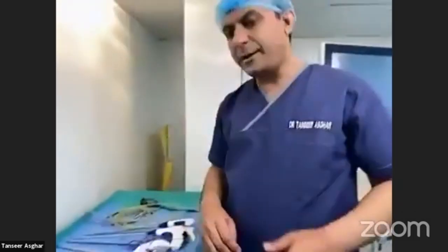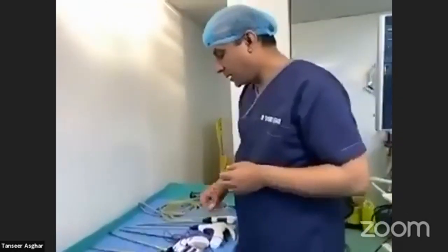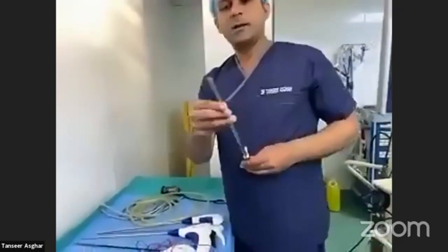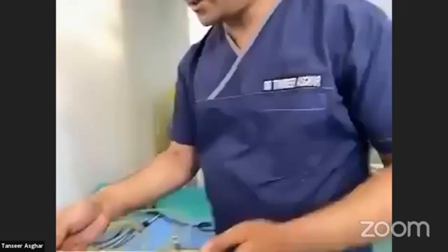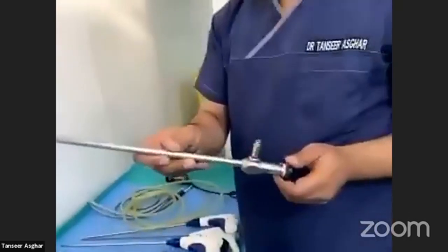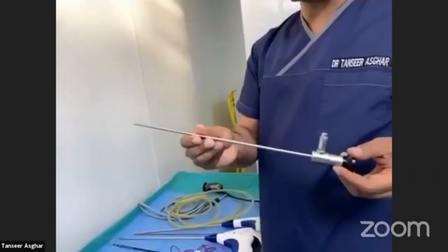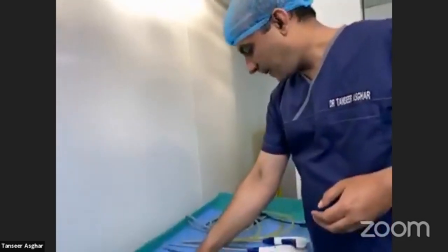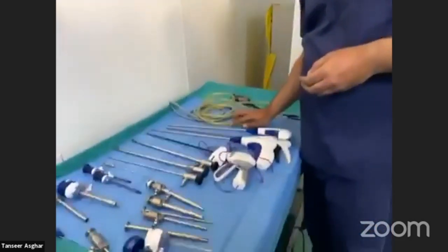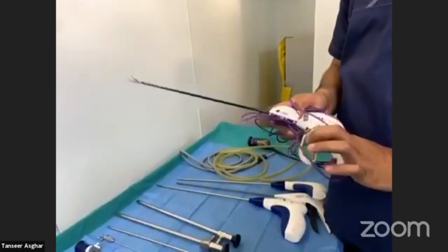This was a brief description of important instruments used in basic laparoscopy. I also want to mention the telescopes: this is a 0-degree telescope, 10 mm in diameter; this is a 30-degree telescope, 10 millimeters; and this is a 5 mm telescope with 0-degree angle.